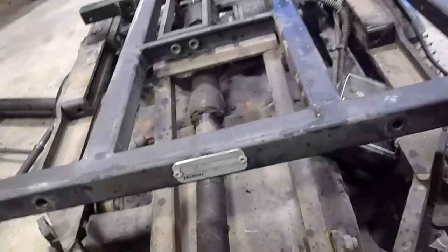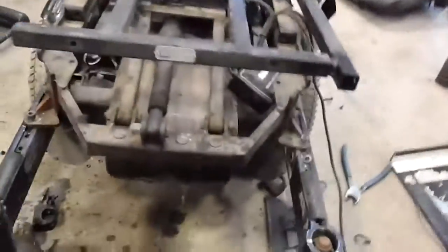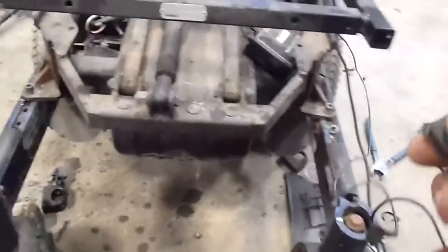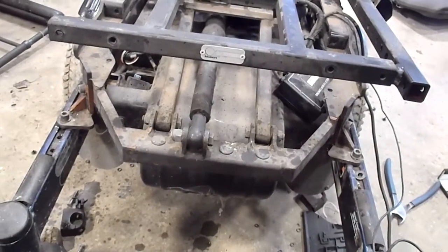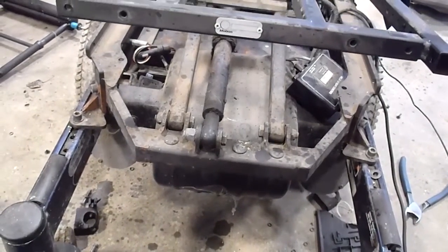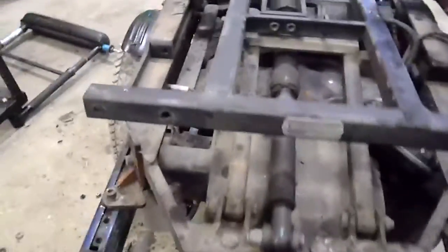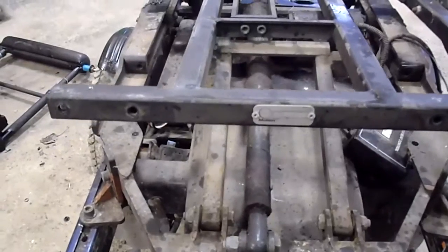So what I've got to do is lower this right down. I'll turn it on. Where's my seat button now? I took all the wires off, so I don't pull anything out here. I'm also going to mount this stuff in a really easy to get at place. All right, let's see. Come on, little girl. There we go. Just lower this all the way down. Okay, it looks like that's as far as she wants to go.